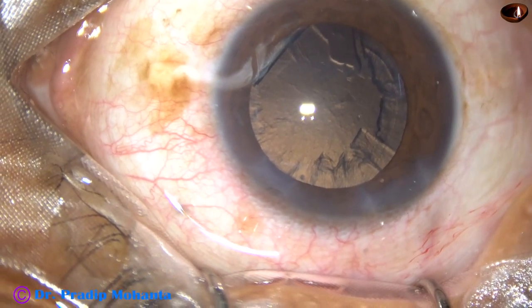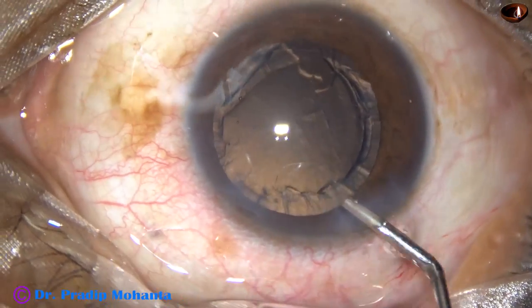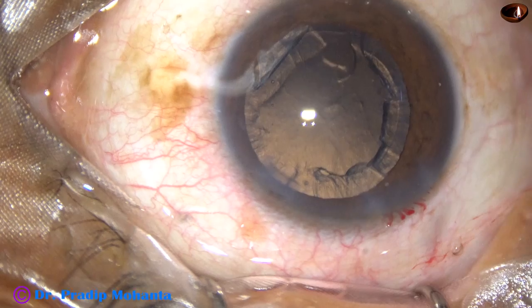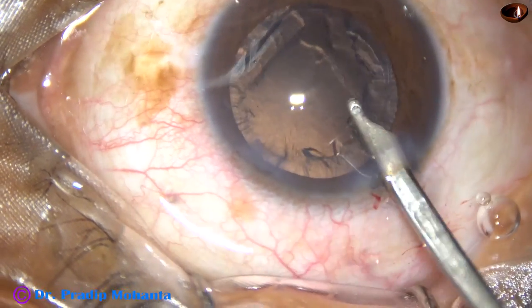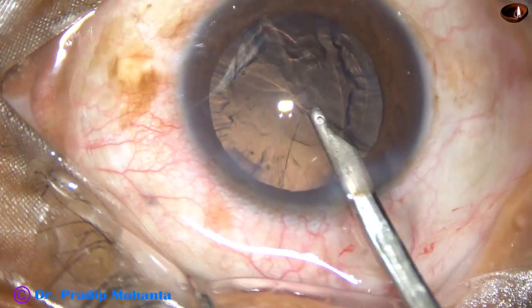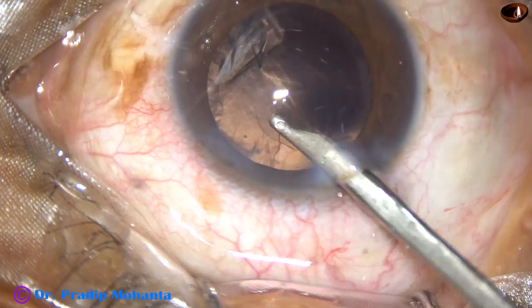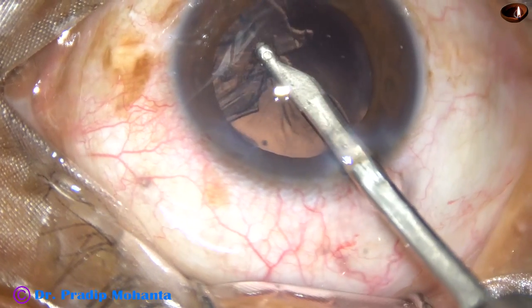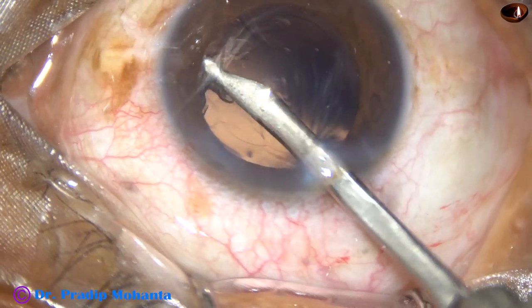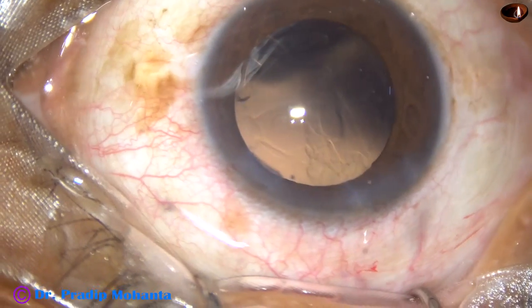Now I am injecting visco — this is 2% HPMC. I am going to use a 23-gauge Simcoe cannula as coaxial irrigation-aspiration. First, when the visco is in place, I remove the sub-incisional cortex first, and then I remove the rest of the cortical matter. This has been a very fast removal of cortex.